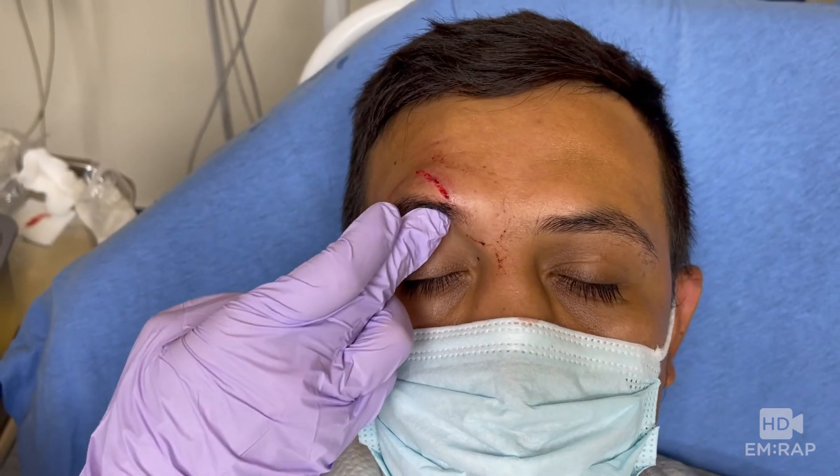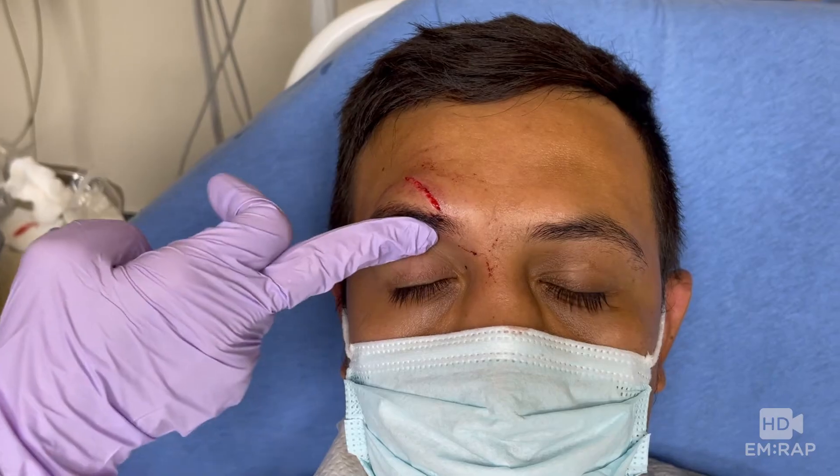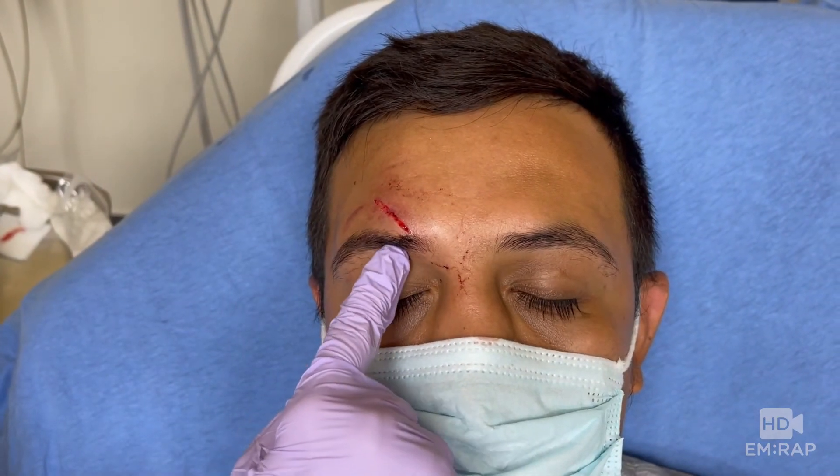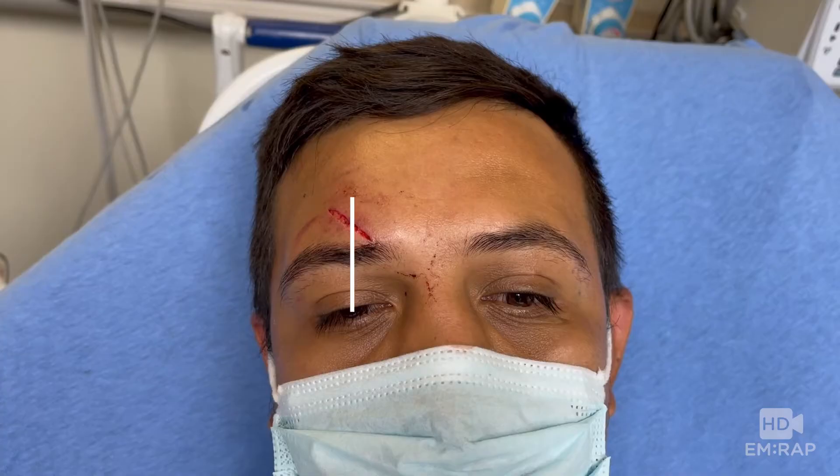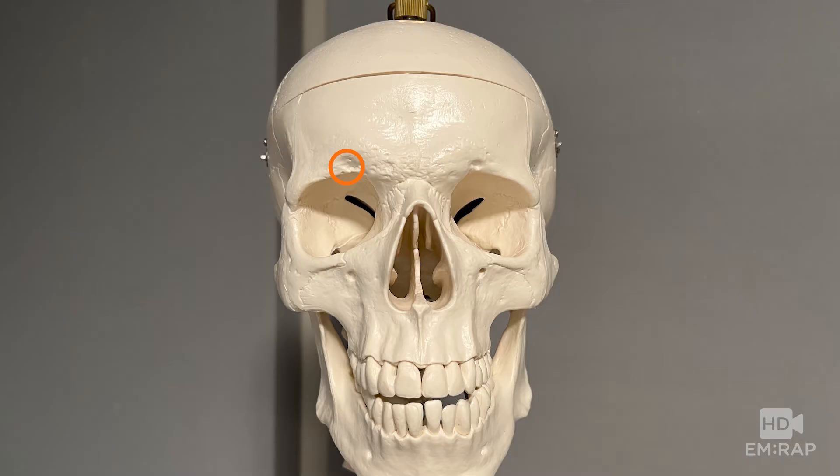The technique is very straightforward. You're going to find that supraorbital foramen along the orbital rim superiorly, and it should line up with the patient's pupil when he's looking straightforward. Here it is on Skelly for reference.